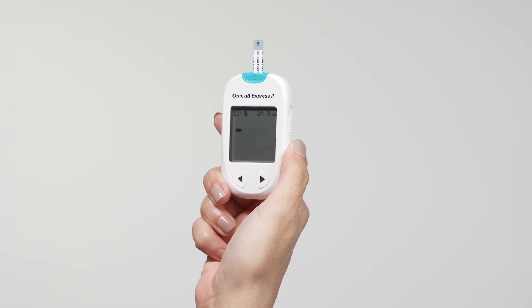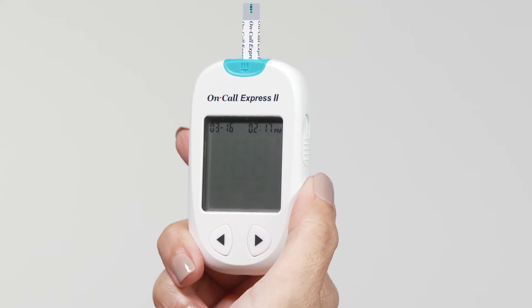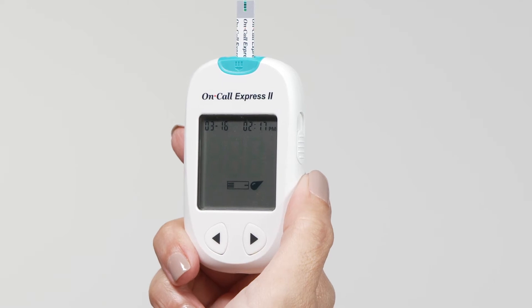Following this display check, the system will enter the test mode. The display will show the date and time and the strip icon with the blood sample icon blinking to indicate that the test strip is inserted correctly and the drop of blood can be added.